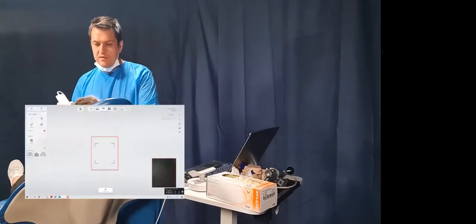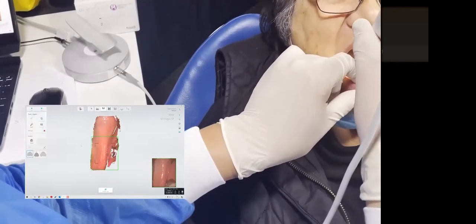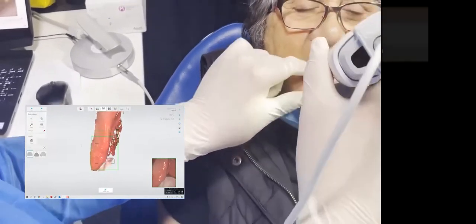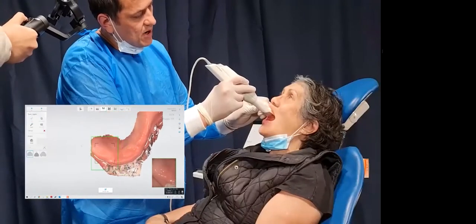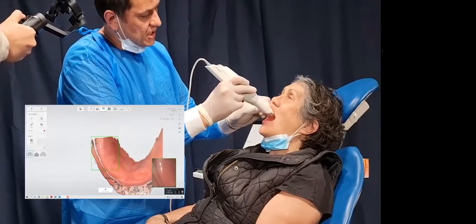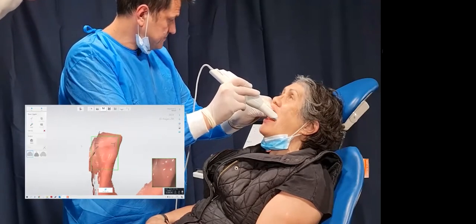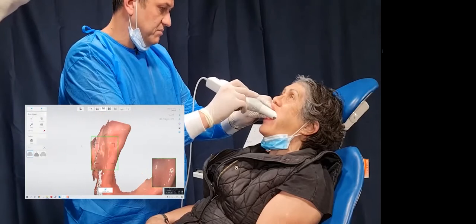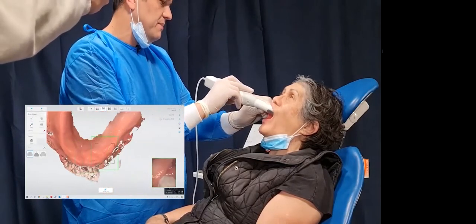Opening up for me. Now open up, we're going to do the top here. So I'm going to start right down the back, hamular notch in quadrant 1. And if you notice my fingers again, in this instance, my index finger is actually up inside the sulcus. Now if you're watching the screen, watching me, you can see the hand position. Now I like to come back down and do a little bit of the sulcus as I make my way back.